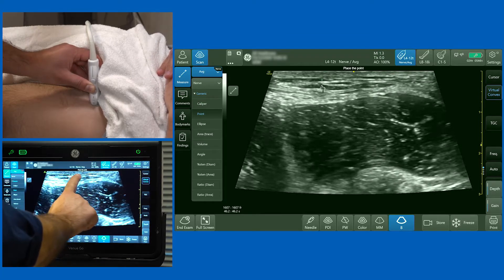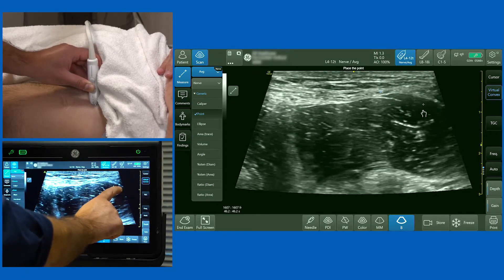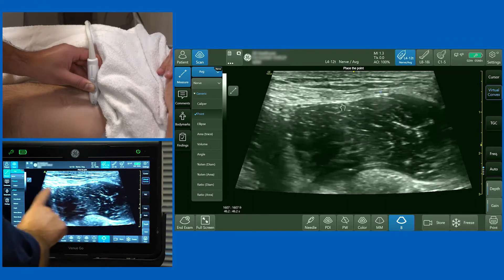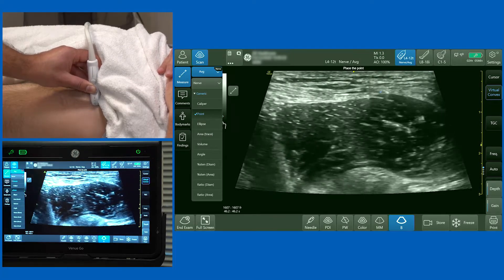You've got a very thin layer of adipose on top, and then you will have the fascia lata and the fascia iliaca. The fascia iliaca lies right on top of the surface of the iliacus muscle. At this point we haven't even brought any of the normal landmarks into view other than the muscle.